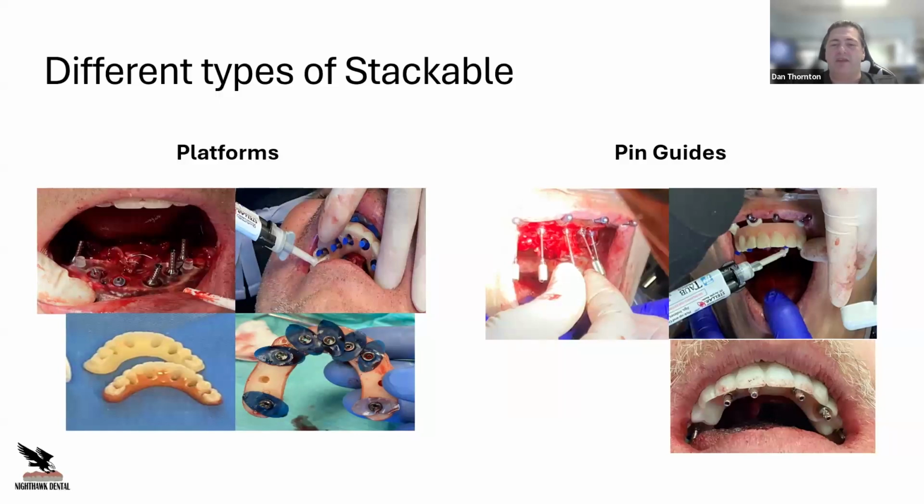I've actually seen some that don't really use the guide at all. It runs more off the palatal area, almost like a table stand would, which is a very cool guide also. The only problem is if anything changes in that palatal area, it doesn't really fit. Now, with that said, you can have anywhere from an FP1 to an FP3 on these kinds of cases. That's where a lot of the planning comes in with these stackable guides.